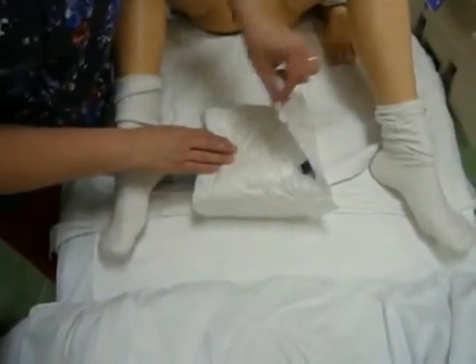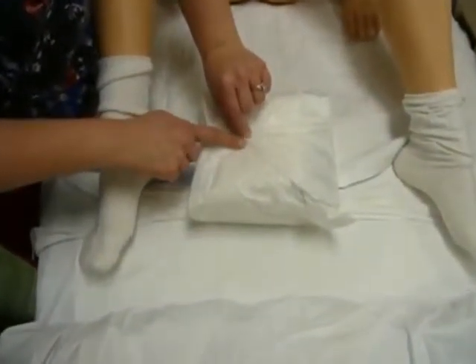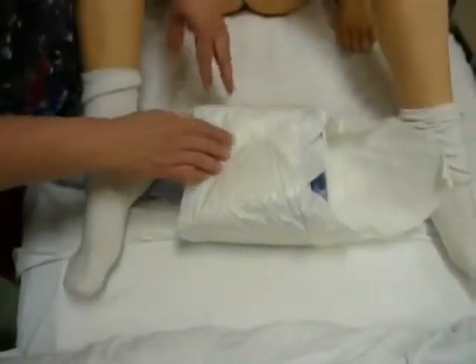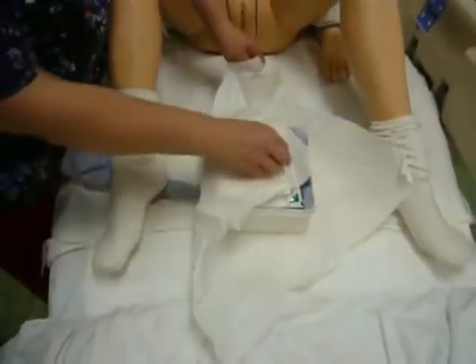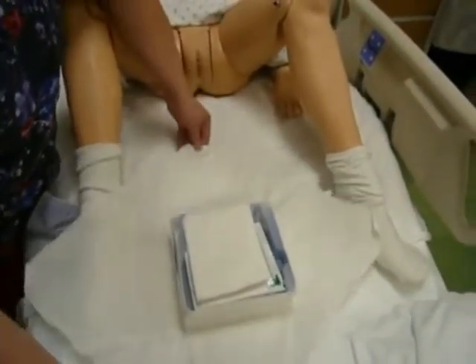Now when you are opening your foley cath kit, you want to make sure that the first tab that you open goes away from yourself so you don't cross over your sterile field. After you open the first tab, the other one should walk around in a fashion that you can make sure that you're not crossing over your field.